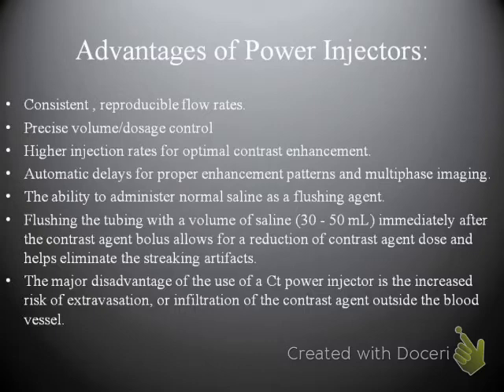The major disadvantage of the use of a CT power injector is the increased risk of extravasation or infiltration of the contrast agent outside the bloodstream or blood vessel. Basically, because you're using such a high flow rate and sometimes higher pressure, typically you don't actually know that you have caused infiltration to occur until it's almost too late.